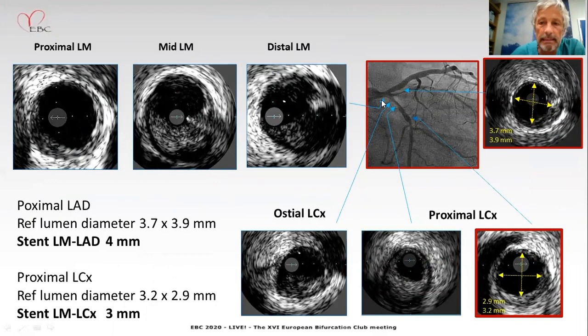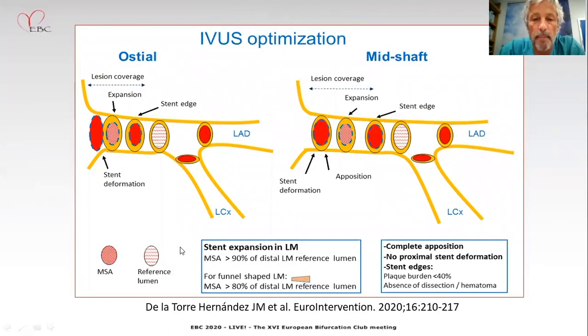In this more complex distal lesion, the distal landing site for LAD is this point and for circumflex is this one. For LAD, 3.7 to 3.9 mm — the selected stent is 4 mm in diameter. For circumflex, 3.2 to 2.9 mm — three millimeters diameter selected.